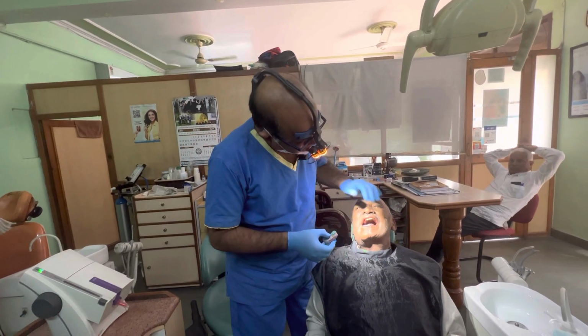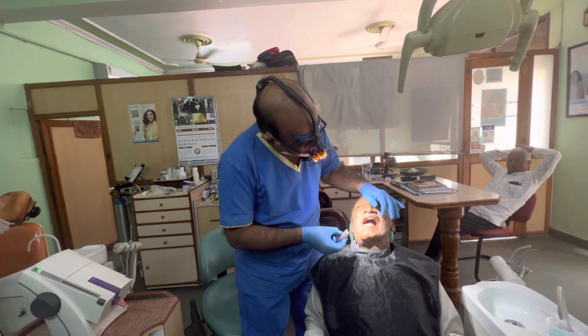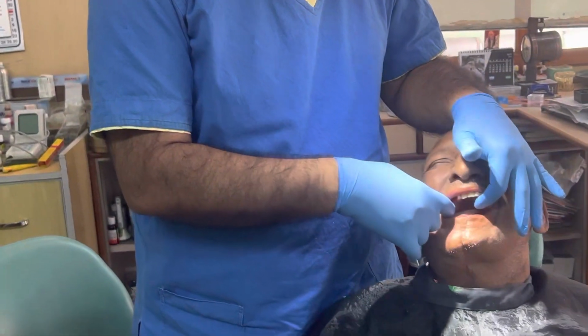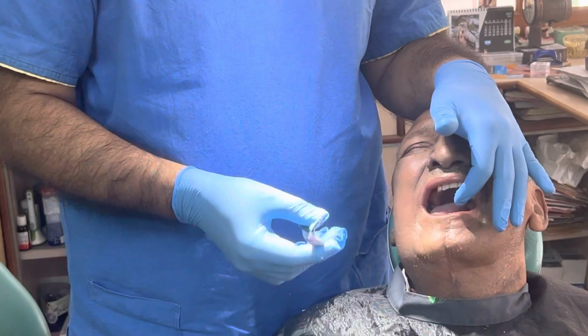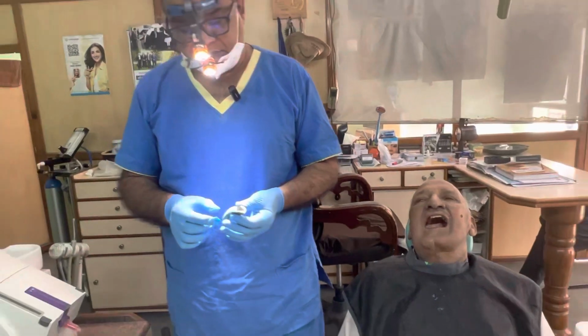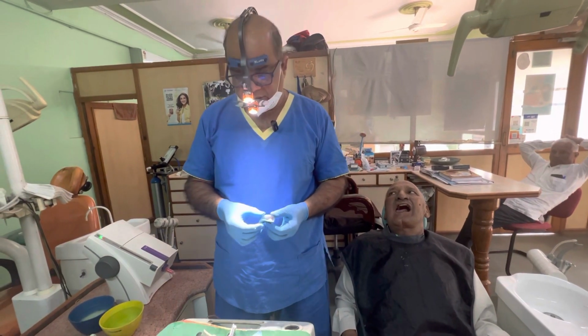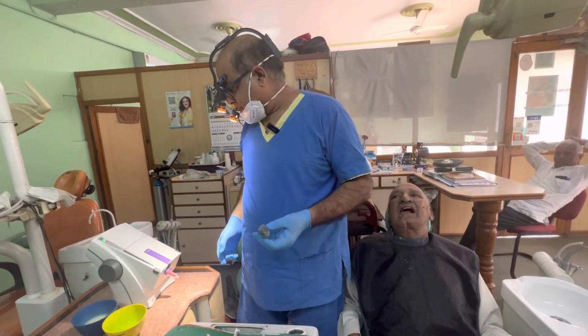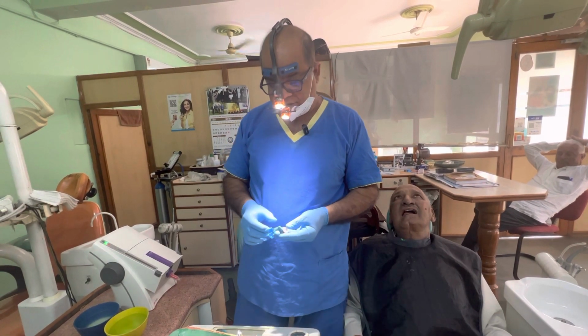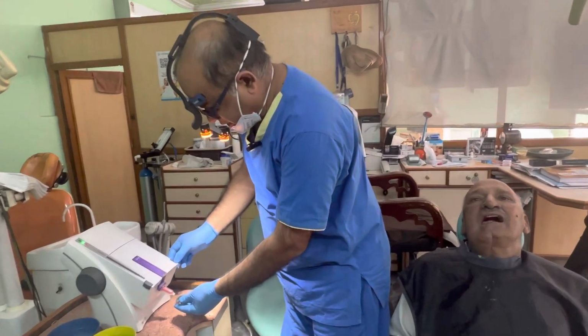For a guiding appliance, we have to make impressions. There are many challenges. The patient has a dry mouth, mouth opening is restricted, there is trismus. So we have to make an alginate impression and then modify it. In this case, I have made an alginate impression and modified it. Now I am making the final impression. So I will show you how to make the final impression.